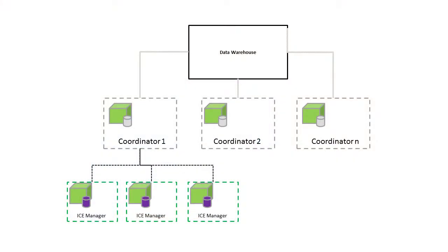It can happen at the hospital unit. This is scalable, and it moves up through the system to the point where you can have a data warehouse, a really rich set of robust data that currently doesn't exist. Because you don't have the waveform data, you don't have the alarm information, and you don't have the context around that. What was the nurse seeing at the time? What were their notes? All of this has to come together to make a system where you can understand what's going on.